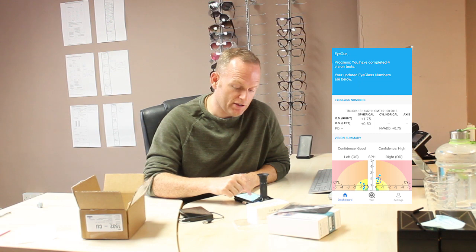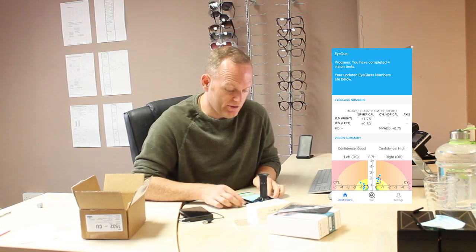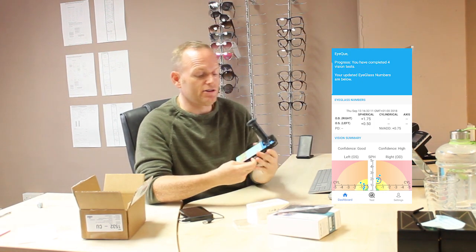There we go — as easy as that. It's a complete vision test looking at the powers. One eye is weaker than the other, which is correct in my case. It says I'm long-sighted in that eye, which is spot on, and there's a clear difference between the two. It's got confidence ratings — good confidence and high confidence — and then you can see a number of measurements on the dashboard.